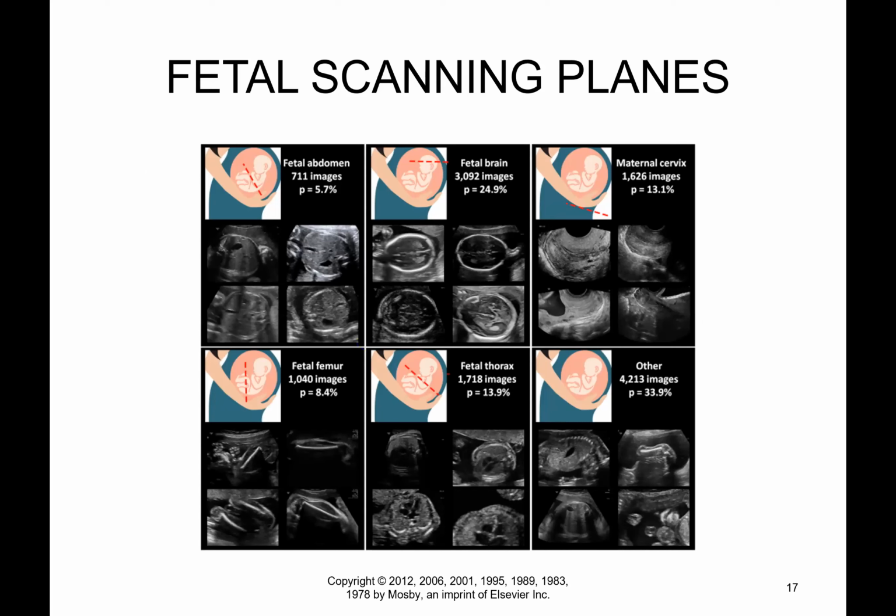I just use that stomach so much to make sure everything is in its right spot. Now, I found this on the internet because in your book, it really doesn't talk about fetal scanning planes as much as maybe it should. I think part of the reason is because it's hard to just put into words. It's one of those things that you're just going to have to scan and learn that way. But I did want to show you these are the different fetal scanning planes, and this is how we really look at different things.